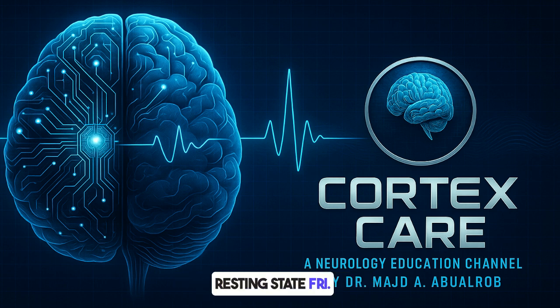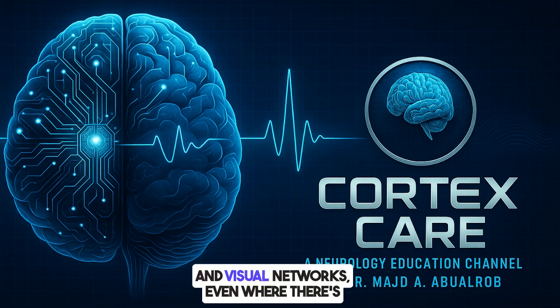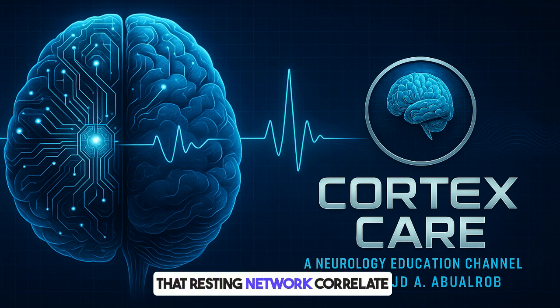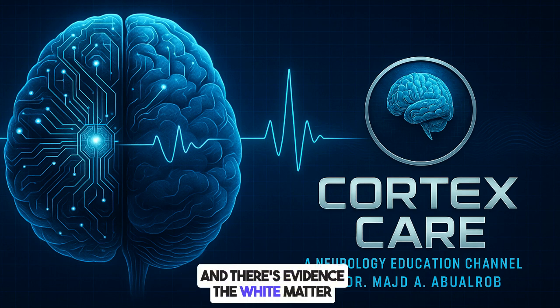Right. Resting state fMRI, looking at brain networks, finds altered connectivity in sensory and visual networks even where there's no obvious structural damage. Interesting. Damage to the hippocampus seems to disrupt its connection with major brain networks, and changes in the default mode network, that resting network, correlate with memory performance. Like the brain is trying to compensate. Possibly, yeah. And there's evidence the white matter tracts connecting limbic and other brain areas might be affected too, which could explain why some patients have both limbic and other symptoms.